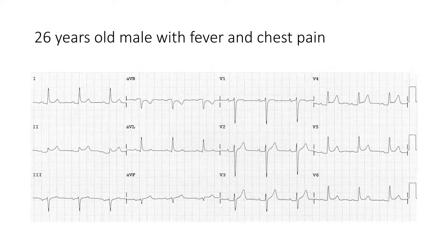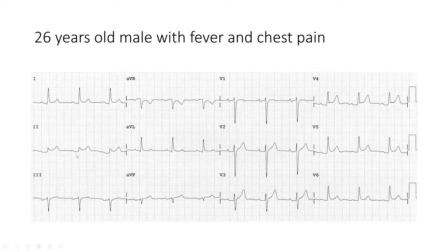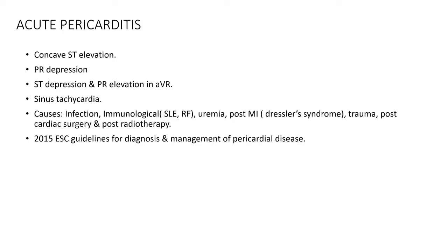Next ECG is from a 26-year-old male with fever and chest pain. Starting with the limb leads, axis is normal. The obvious finding is concave-type ST elevation. The PR segment is depressed, and in AVR the PR segment is elevated and the ST segment is depressed. The ECG is conclusive for acute pericarditis. Findings: concave ST elevation, PR depression in most leads, ST depression and PR elevation in AVR, and sinus tachycardia.